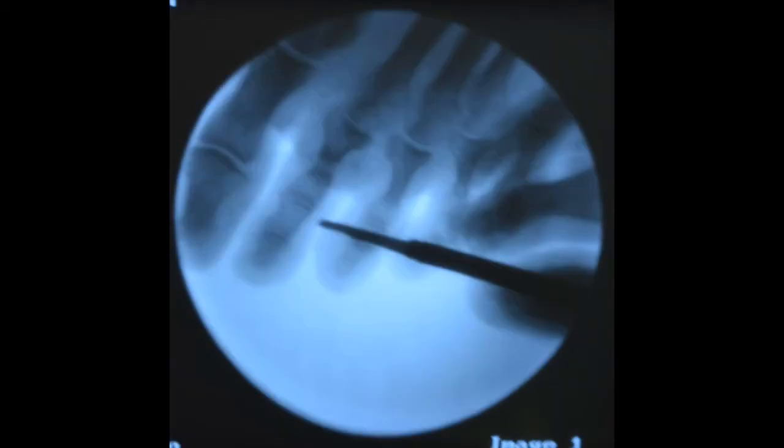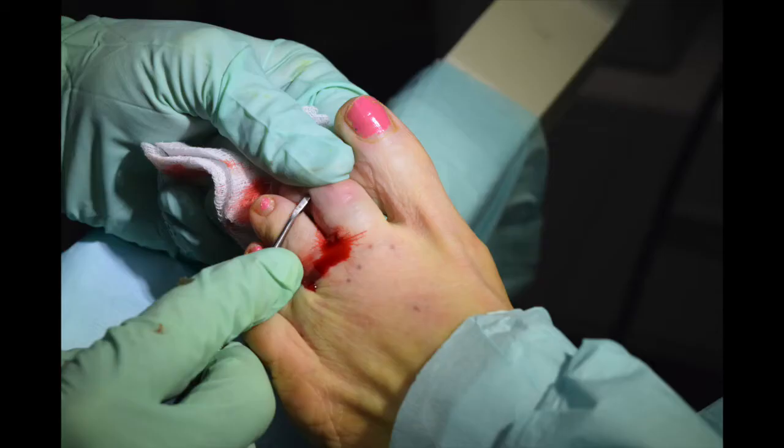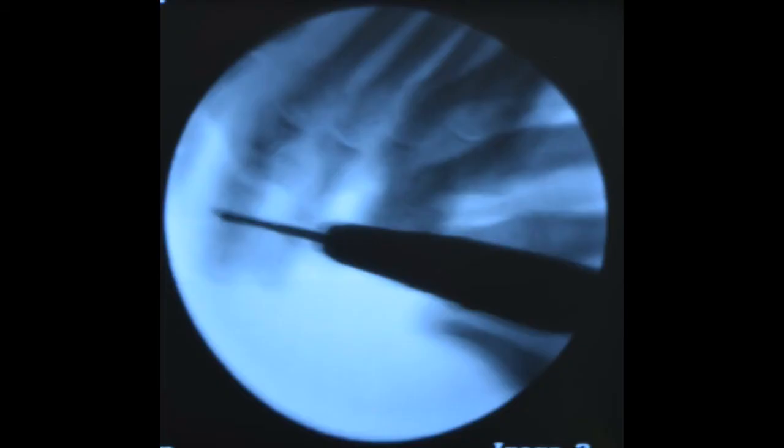We're doing a wedge osteotomy and also an osteotomy on the middle phalanx to allow even more correction of the toe. It's not necessary to cut the tendons in these types of patients because you actually get a better correction by doing double osteotomies, using the strength of the tendons to help with healing.